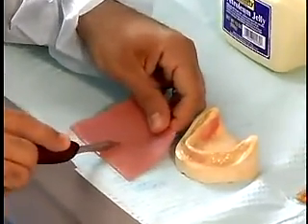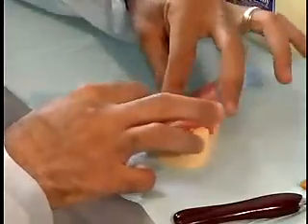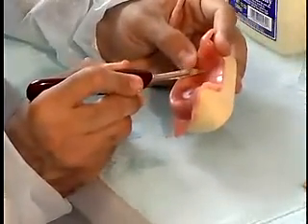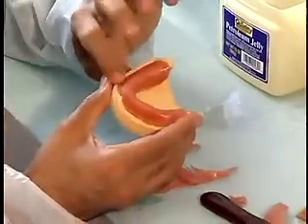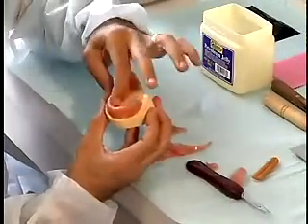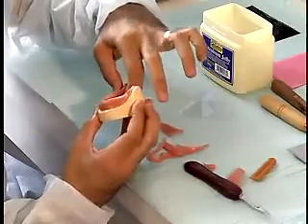Cut a V-shaped wedge out of the middle of the triad sheet to permit adaptation of the wafer to the lingual of the cast. Adapt the material as before and cure. Follow the same instructions as for the maxillary tray. The procedure for the mandibular record base is identical to the maxillary.